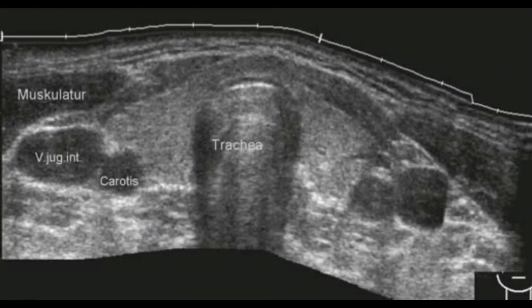So these are all the anatomical structures and landmarks for the thyroid examination, especially when you are trying to look for a nodule and applying the classification for the thyroid nodule. So this will help you.